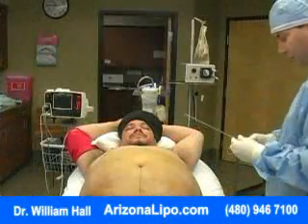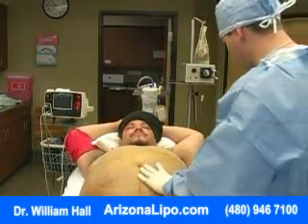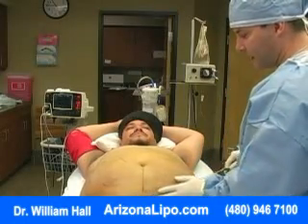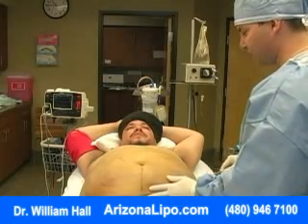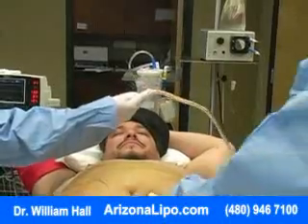Okay, so we're going to start the suctioning now, Alex. Okay. So mainly you're going to feel a little bit of pressure, okay? If you feel anything that is burning or pinching, you just tell me and I'll put a little bit more anesthesia. But mostly it's just going to be a little pressure. Just kind of an odd sensation, huh?